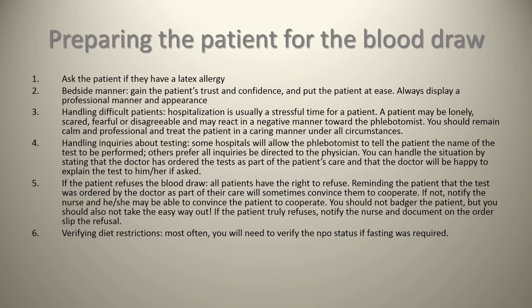Verifying diet restrictions. Most often you will need to verify the NPO status if fasting was required for the test. This is usually required for things like LDL, HDL, and cholesterol tests for the patient.